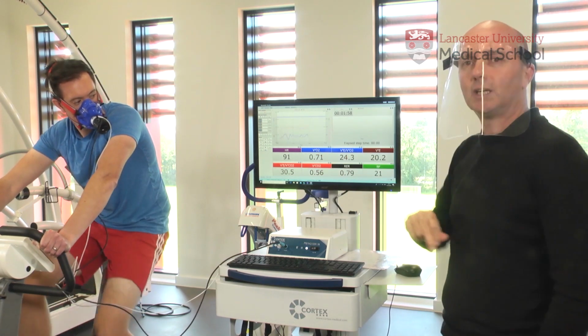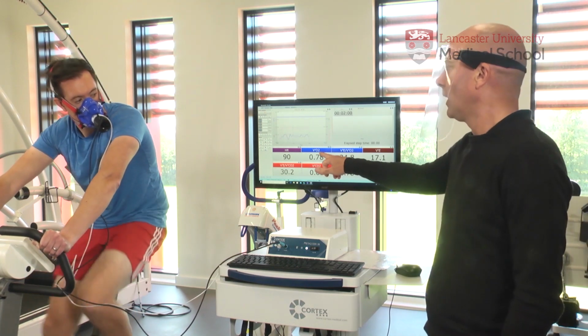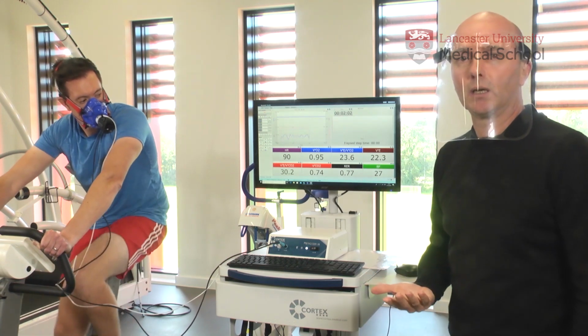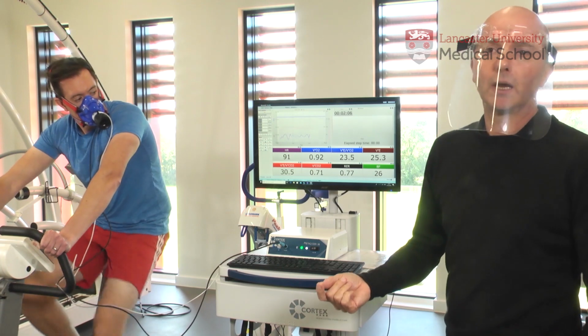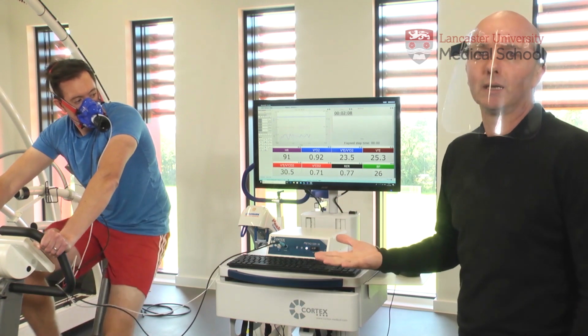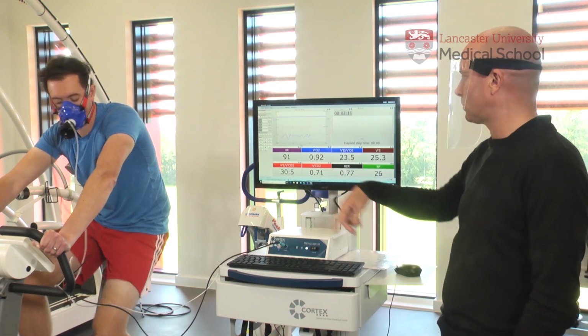We've got his oxygen in litres per minute. And because we're doing a lactate threshold test on the bike rather than running, we're not using the millilitres per kilogram per minute, we're using the litres per minute.